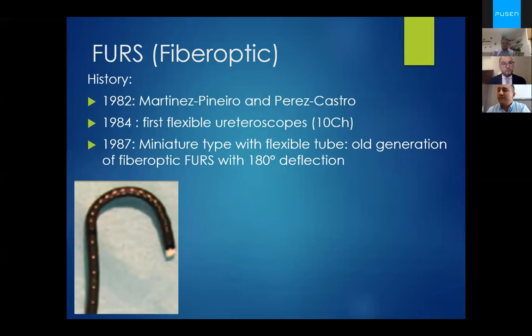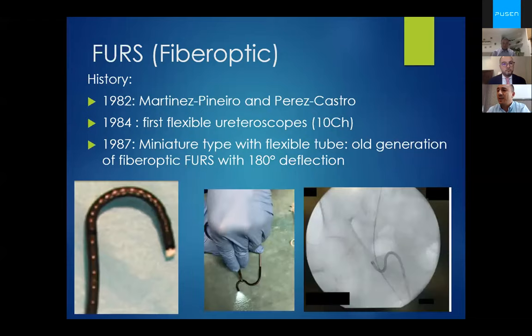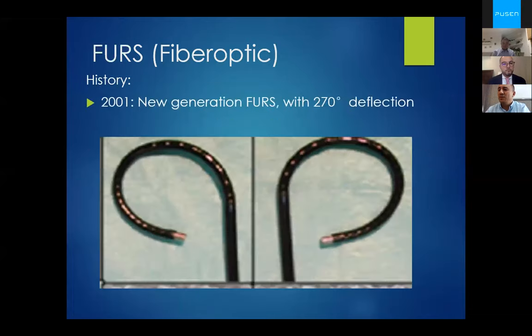There is also a passive deflection mechanism, like we see here, obtained by forcing the curvature of the actively flexed endoscope. If the scope is pressed on the pyelocaliceal cavities, this allows it to reach the lower calyx. From 2001, companies produced a new generation of scopes having at least one active deflection of 270 degrees in the ventral direction for all companies, and for some companies, Storz and Wolf, also in dorsal deflection, preserving the characteristics of standard old generation scopes like diameter, length, and working channel.